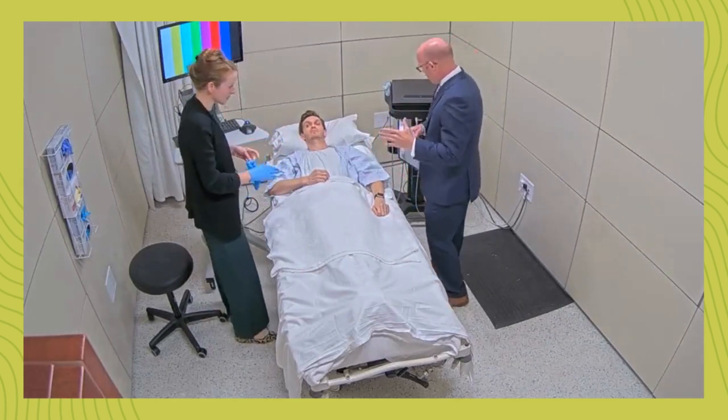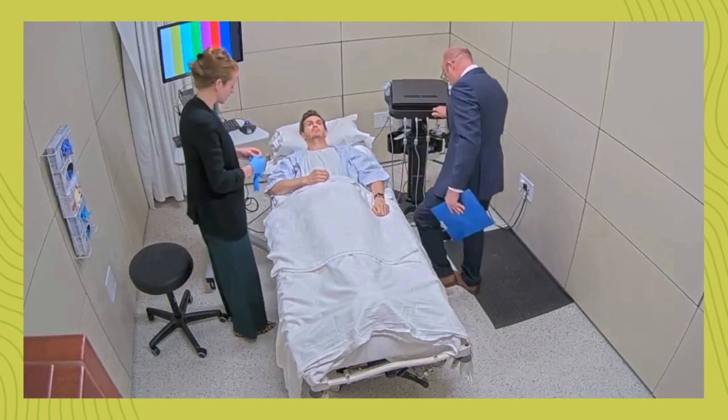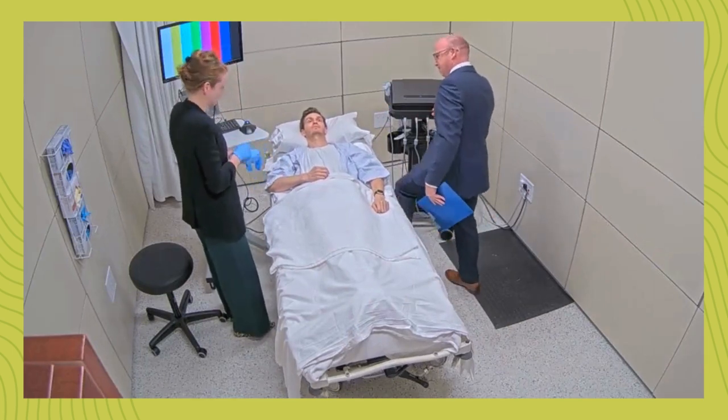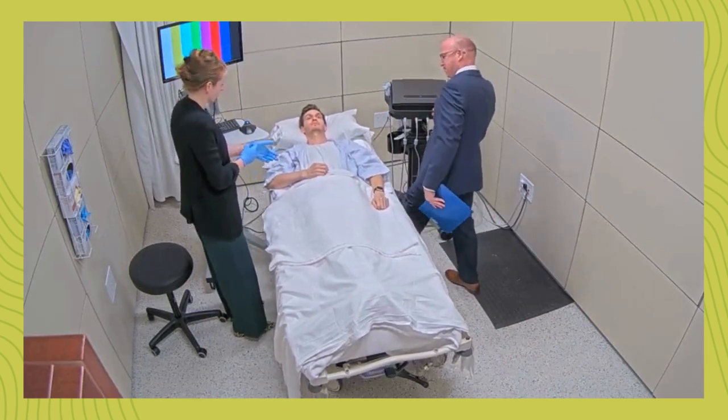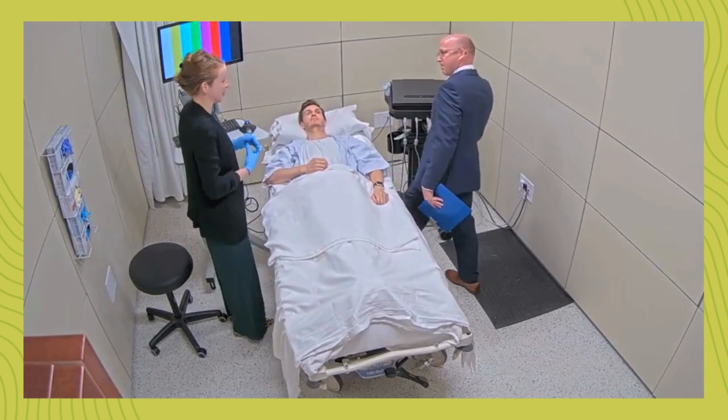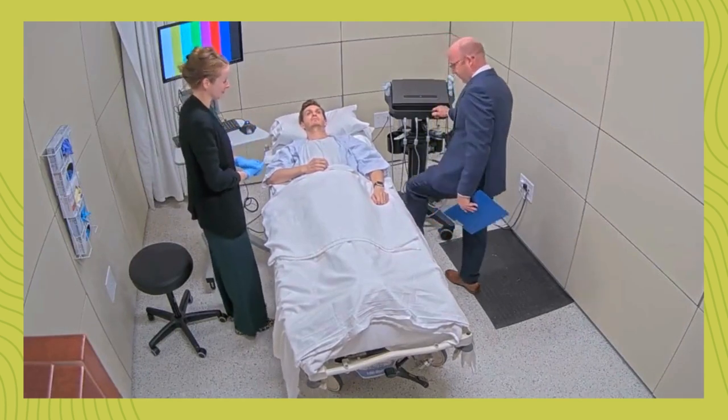Could we raise the bed just a little bit? Absolutely. That's perfect, thanks.